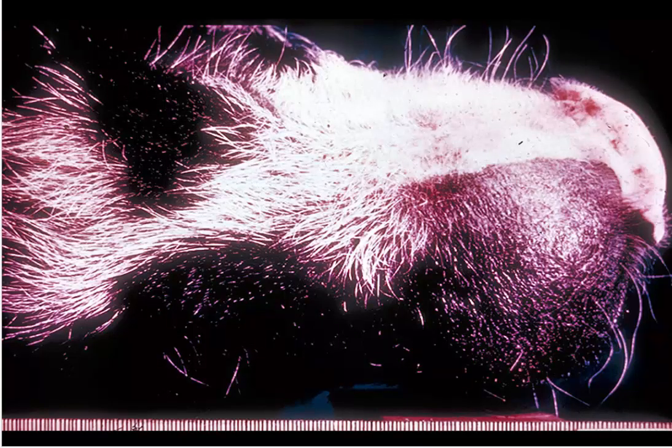Slide number 8 is from a pig, and I would like for you to name the condition and a likely cause.